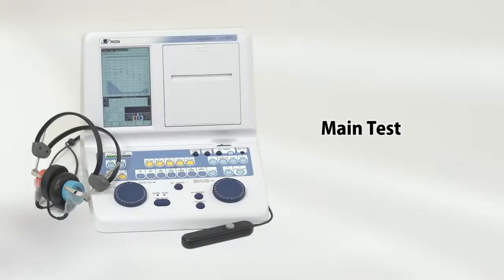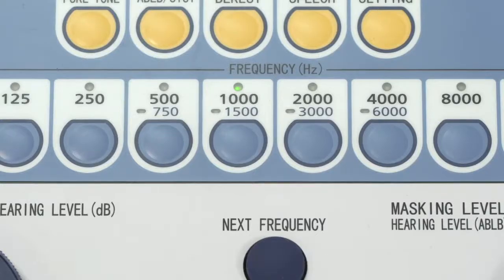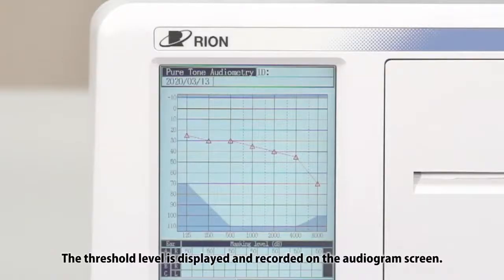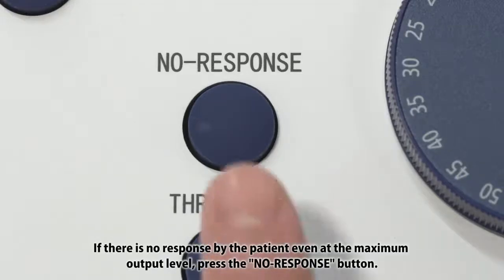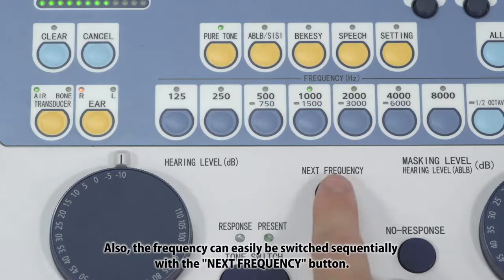Main Test: In the main test, the threshold level is measured at each frequency to be tested. When the patient responds by pressing the patient switch button, press the threshold button. The threshold level is displayed and recorded on the audiogram screen. If there is no response by the patient even at the maximum output level, press the no response button. The frequency can easily be switched sequentially with the next frequency button.